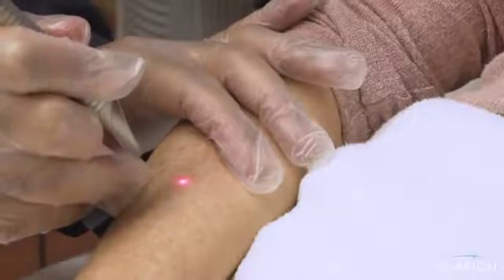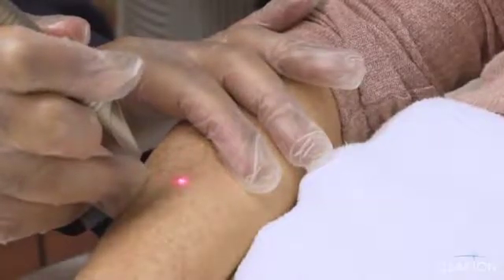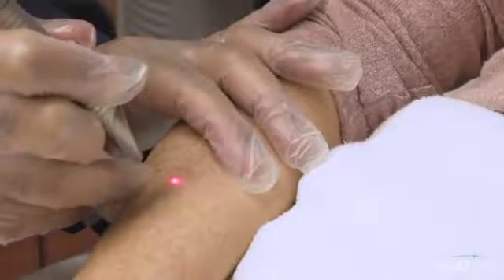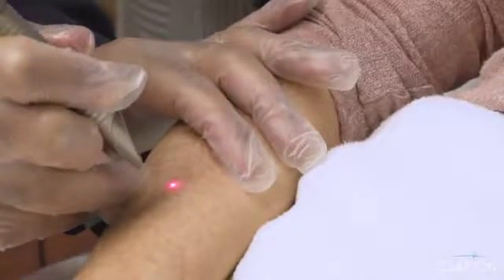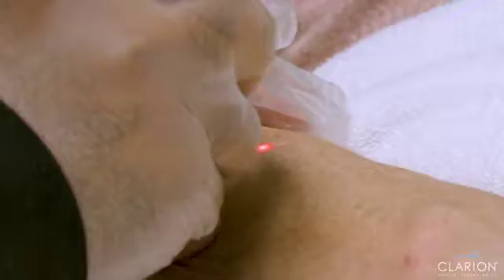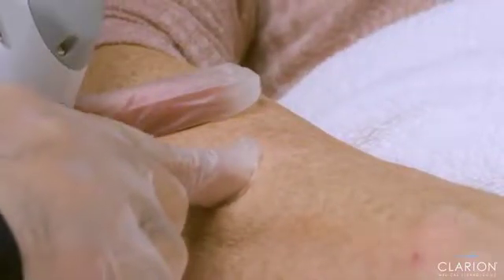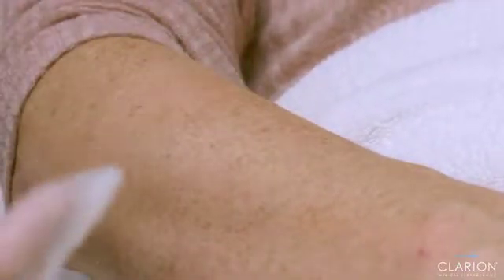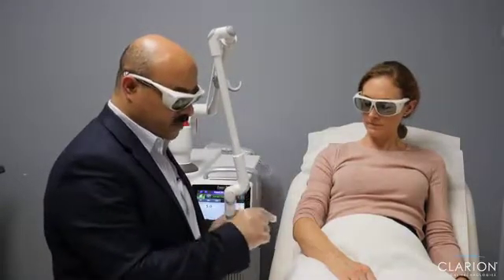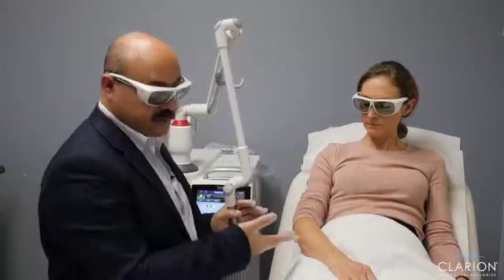I do a little bit of defocusing so that the spot is a bit smaller, so I am able to target a smaller spot. And now even the edge is free and it is not having any pigment anymore. So this is what we do if we have a localized focal lesion which we would like to get rid of. It takes a few seconds.